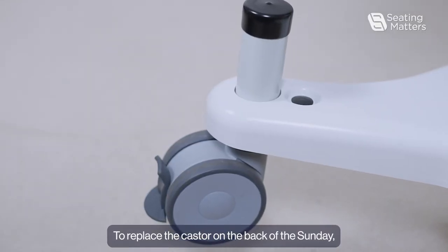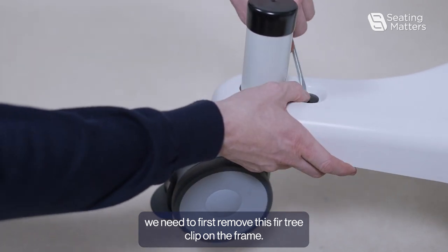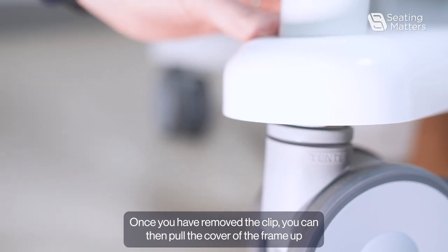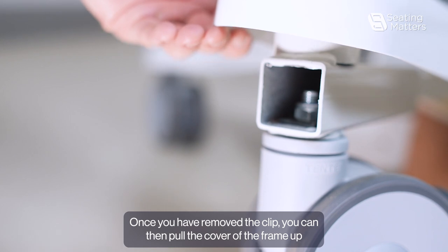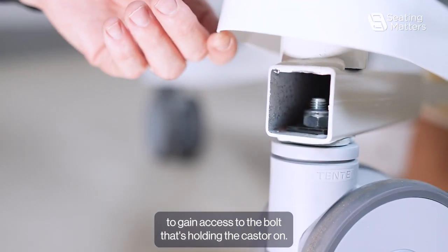To replace the caster on the back of the Sydney, we need to first remove the fir tree clip on the frame. Once you have removed the clip, you can then pull the cover of the frame up to gain access to the bolt that's holding the caster on.